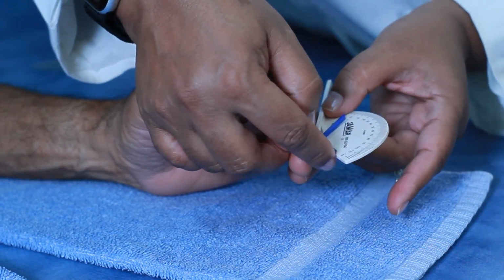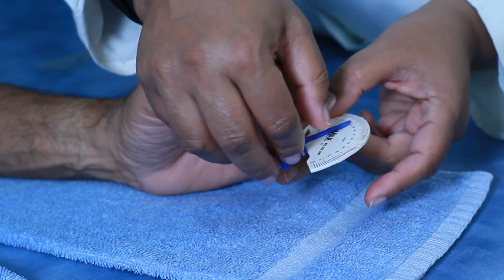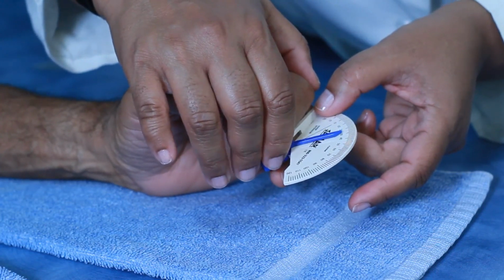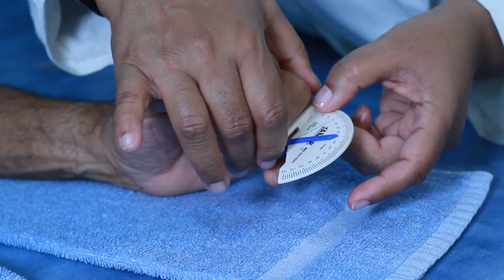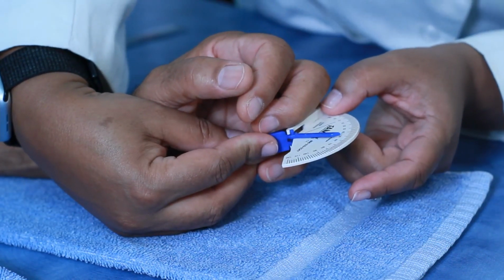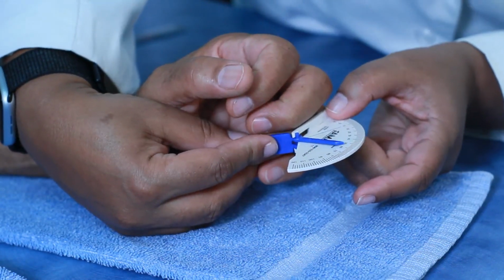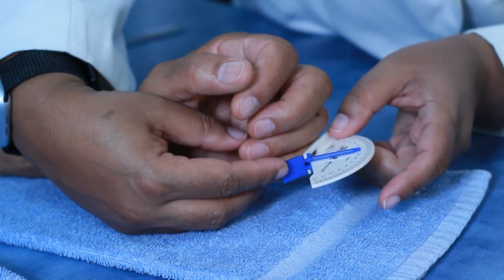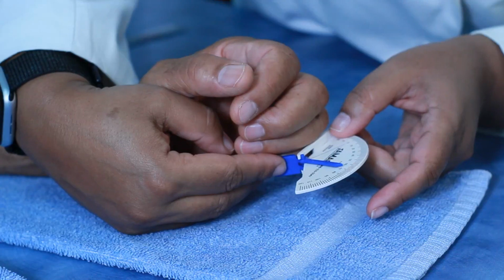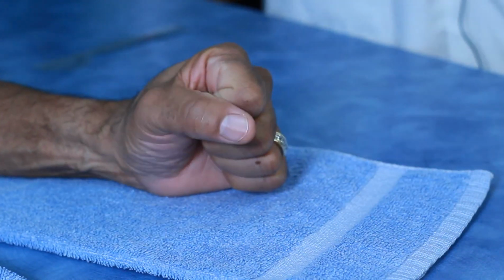Then the ring finger. Let's make sure the fist is still composite. That may be a little bit tricky when you have somebody with an injury. As much as you can though, try to get those fingers moving together. That's going to give us 60, and then over here on the little finger, he's getting a little bit more, out to 70. All right, so those are the numbers for his composite fist.